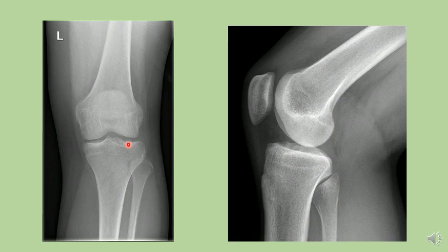Even though cartilages are in contact in standing position, they are not picked up by radiographs. They are allowing the rays to pass through, they become radiolucent, and we see the joint space. If cartilages are worn out, or if there is erosion of the cartilages, the joint space becomes lesser and lesser. The bony ends come together because there is lesser cartilage.